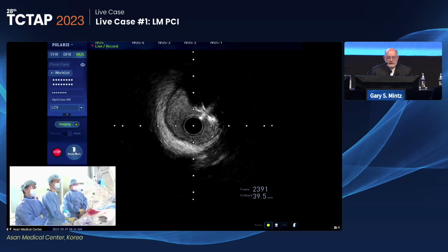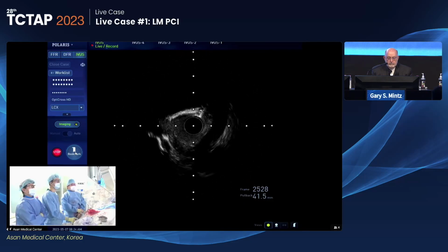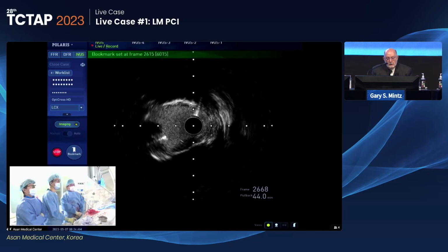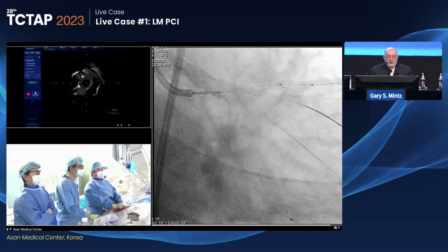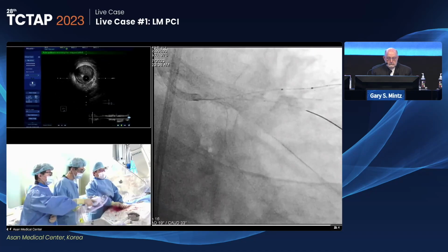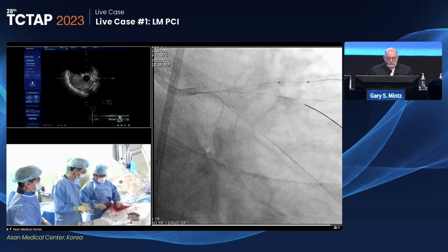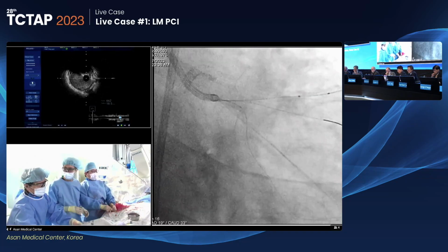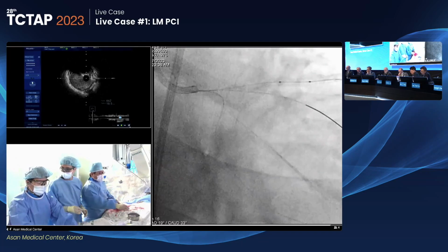We're looking for the LAD guide wire, which tells us that it's the ostium. And this is probably the ostium, LAD. And, you know, it's dilated. You expanded the lumen pretty reasonably with just a balloon. Yes, please give me the 3.0 high pressure balloon, please. To facilitate device passing through the circumflex, I like to do more lesion modification using the high pressure balloon 3.0.